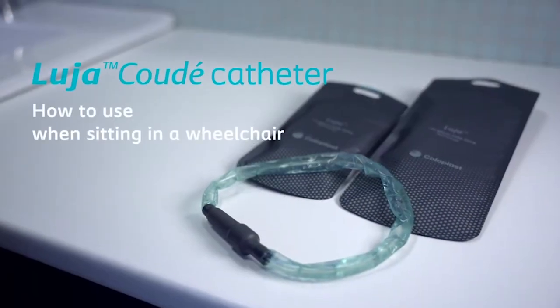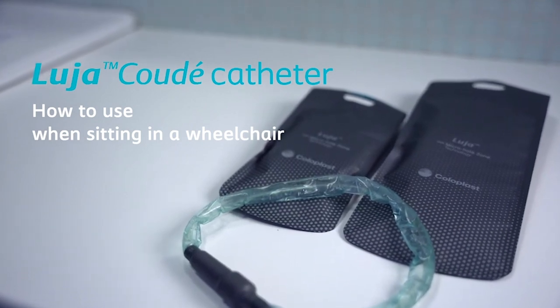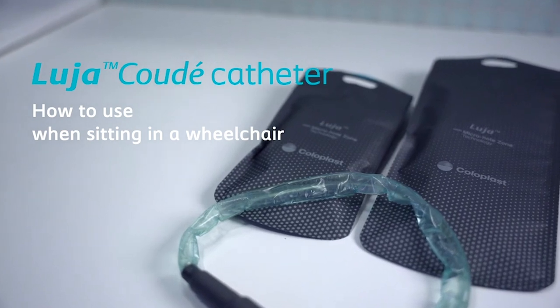In this film, you'll learn step by step how to empty your bladder using the Luja Kude catheter. This film is particularly relevant for users with limited hand function.